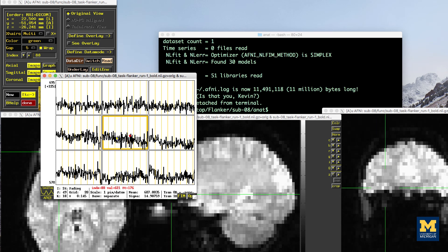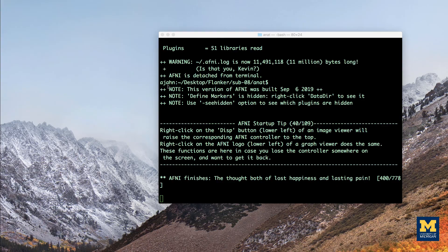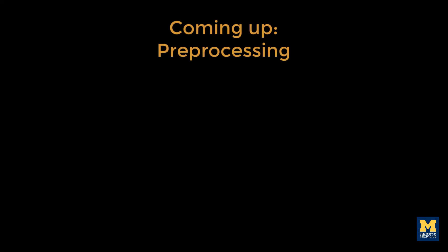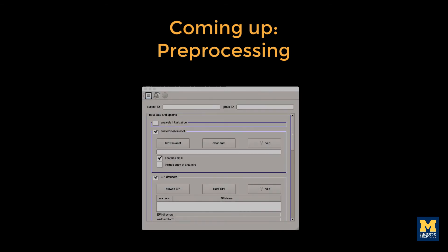When you're finished looking at the data here, click on the red X button in the top left of the controller window, which will close both the controller window and all of the viewer windows. In the next tutorial, we will learn more about how to preprocess our data to remove artifacts and improve the image quality using AFNI's ubersubject.py command.